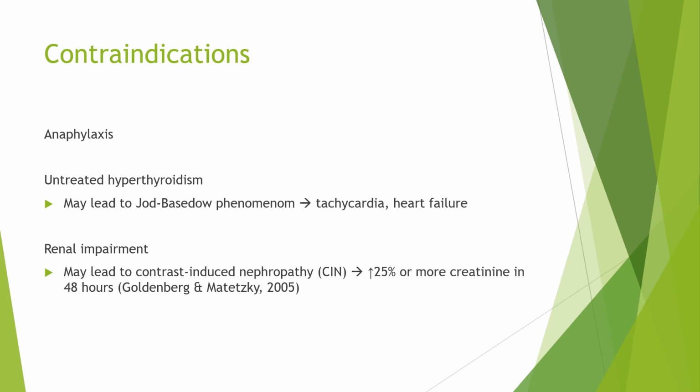Let's finish off by talking about contraindications to CT contrast, and why they are considered that way. Now technically the only absolute contraindication is anaphylaxis to CT contrast. However, the way departments approach this and other contraindications are different, and this video is aimed to just explain why some of the other ones are considered that way.